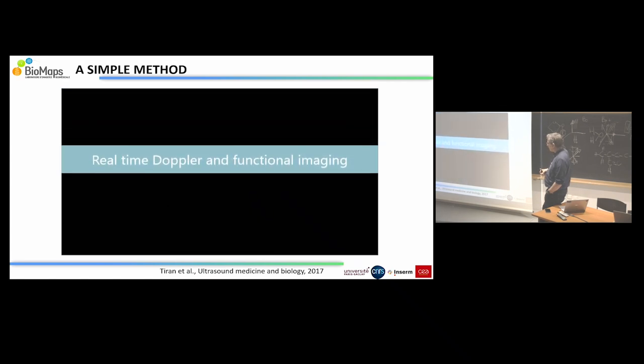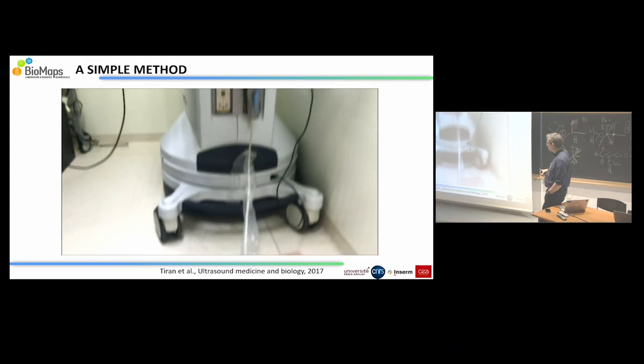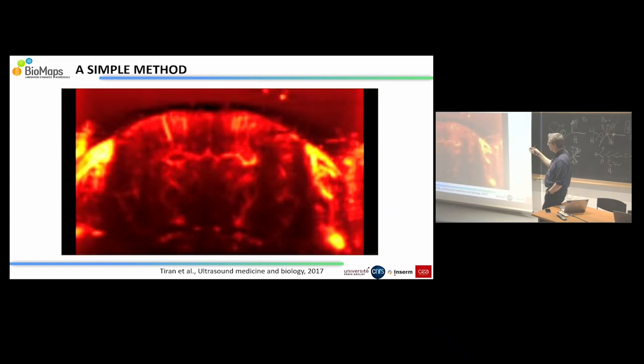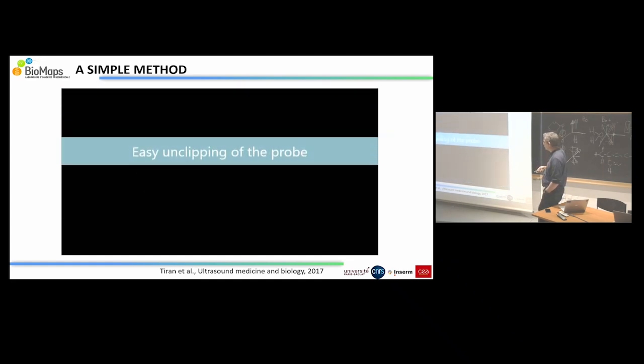And after that, you acquire on the device the acquisition of the mouse brain during some stimulation or whatever you want.